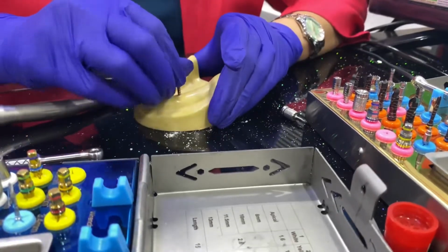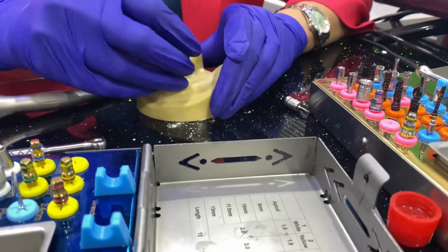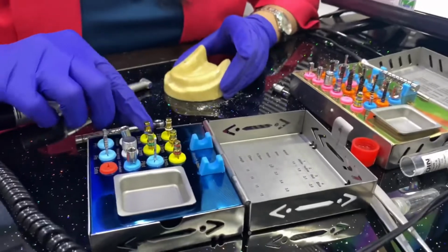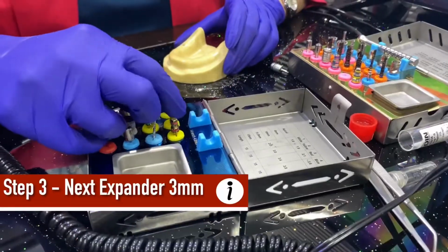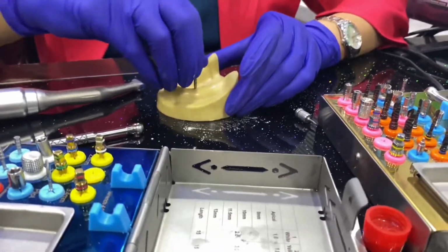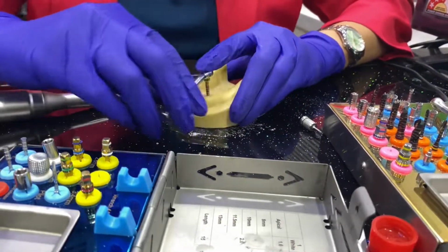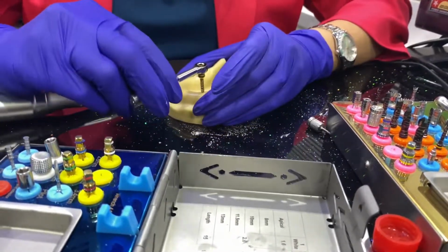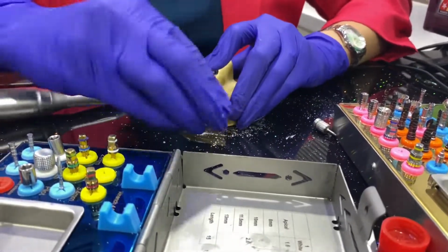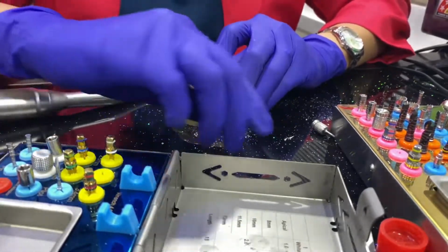As I told you earlier, you can do this either with a handpiece or by hand. I prefer doing it by hand because it gives me better control. Now we finished the 2.6. Now we'll pick up the 3 mm. Place it in the same implant site, and we will keep torquing it inside. This is the reverse one. We'll use the forward one. Slowly, if you can see, my expander is going inside.